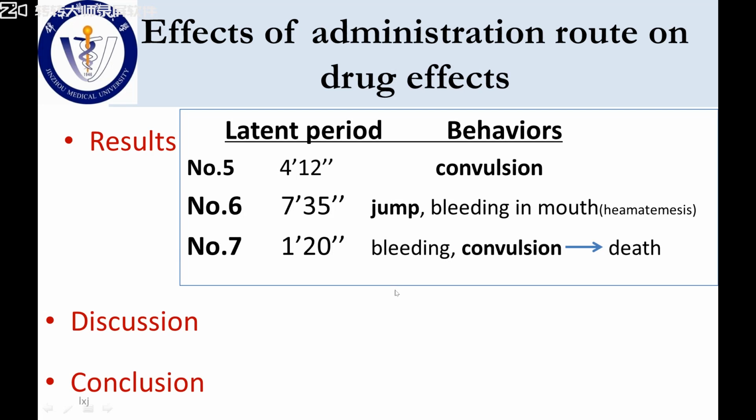Actually, these 3 mice show different stimulant reactions. Number 7 is the most serious. And number 6 is the mildest. And for number 7, the latent period also is the shortest.